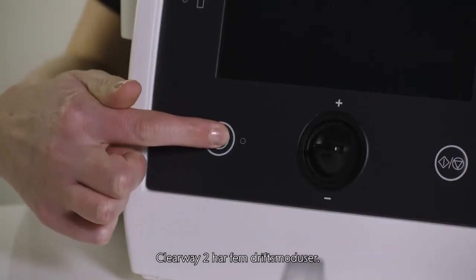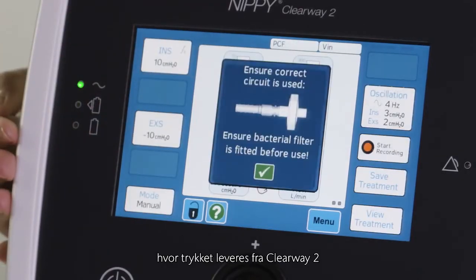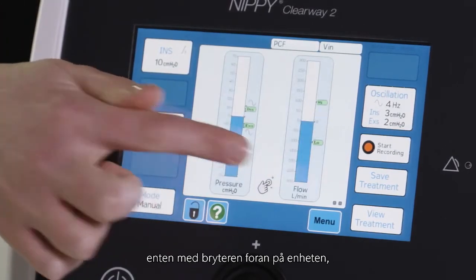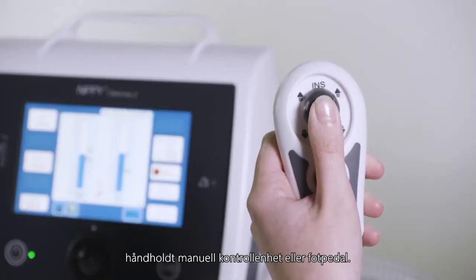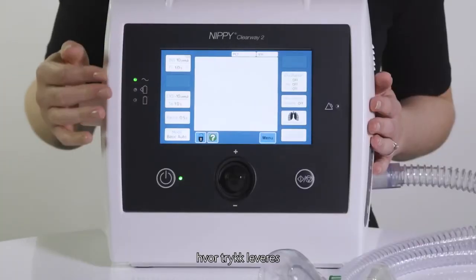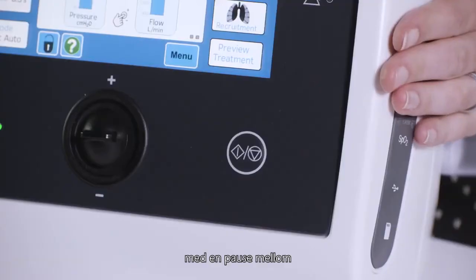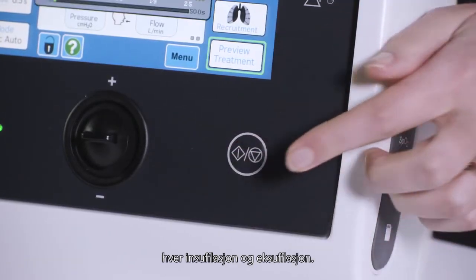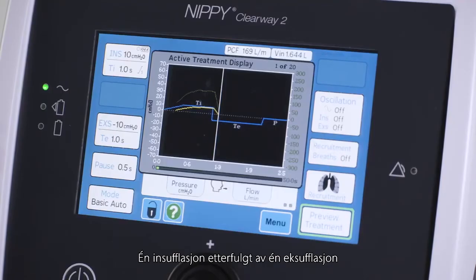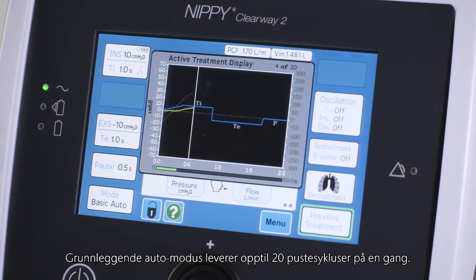The Clearway 2 has five modes of operation. Manual mode, where the pressure is delivered from the Clearway 2 using either the switch on the front of the device, the handheld manual controller, or foot pedal. Basic auto mode, where the pressure is delivered from the Clearway 2 in prescribed time settings with a pause between the delivery of each insufflation and exsufflation. One insufflation followed by one exsufflation followed by one pause time delivery is called a cycle. The basic auto mode delivers up to 20 cycles at once.